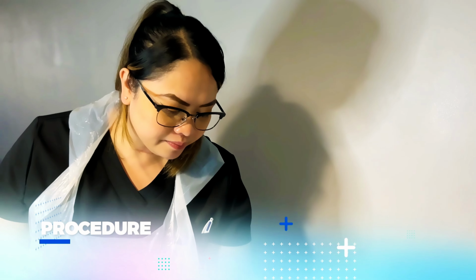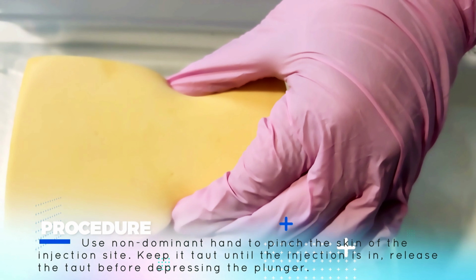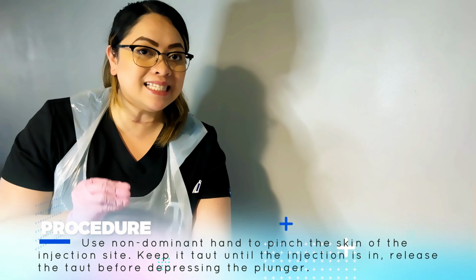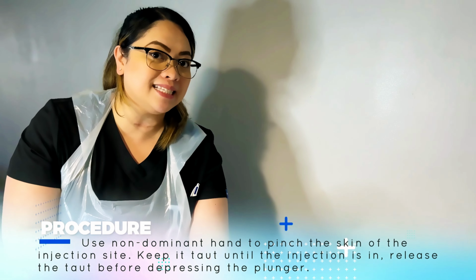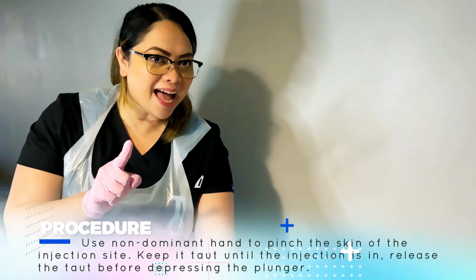Okay, I'm going to use my non-dominant hand to pinch the skin. There you go. Once I pinch the skin, I'm not allowed to remove it unless the needle is already inside, okay? Remember that. That's the difference from the IM. So we're doing sub-Q. Again, pinch it and leave it there, okay?